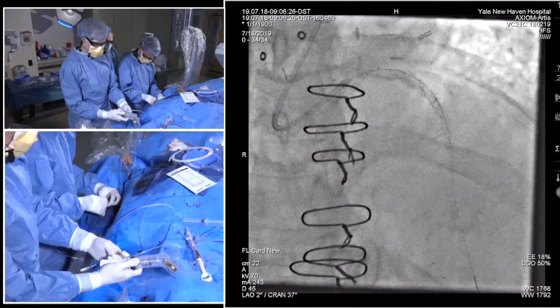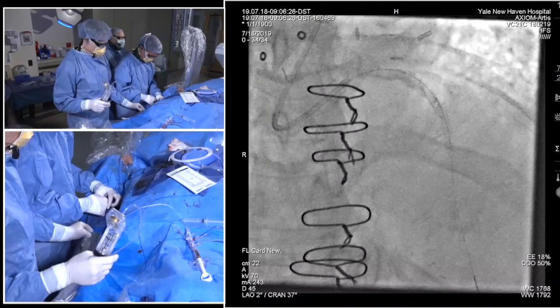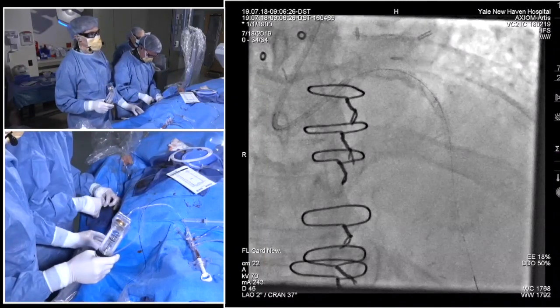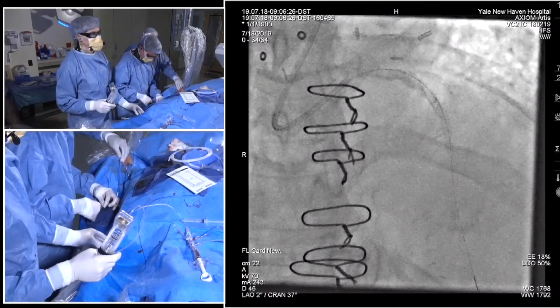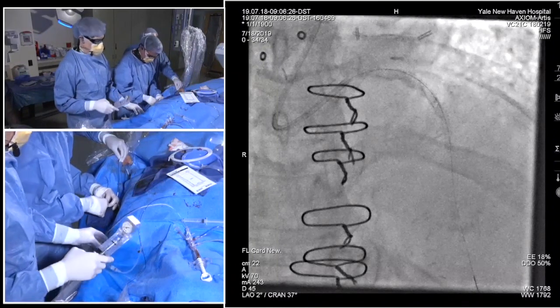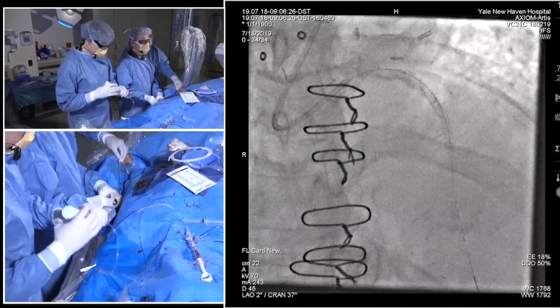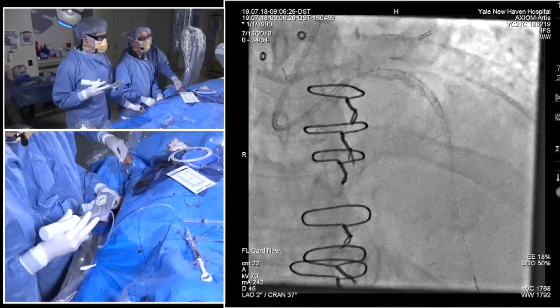I think anytime you're doing a bifurcation where you're going in with an upfront 2-stent strategy, I really think 7 French is just going to save you a lot of time and heartache trying to battle getting 2 balloons through, 2 stents through, et cetera. Yeah, and even you brought up the dual lumen catheter earlier, but trapping that out in a 6 is really tough if you can.